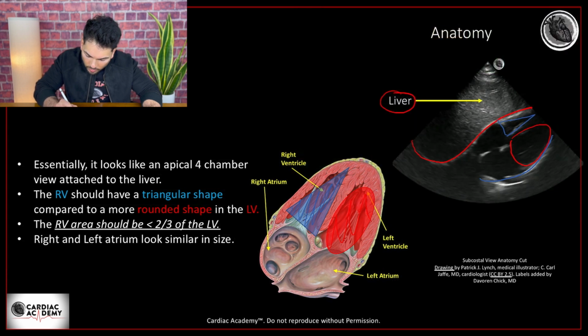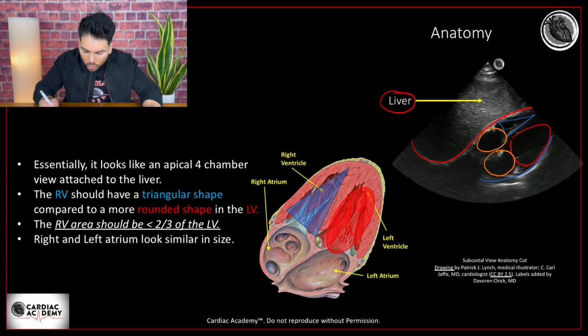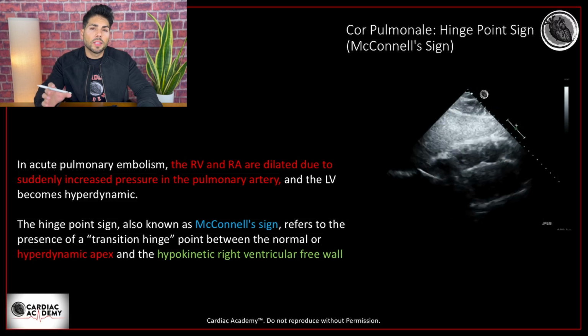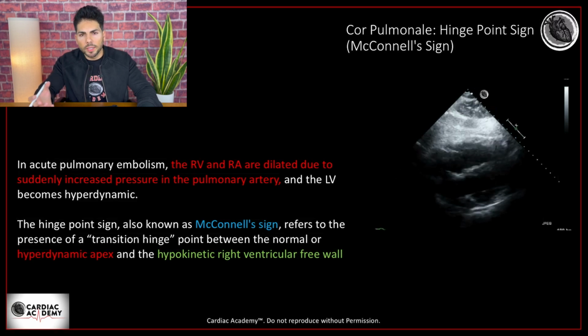You can see here how the right atrium and the left atrium look the same size in this particular view, okay? All right, let's move forward. All right, let's talk about the McConnell sign in pulmonary embolism.